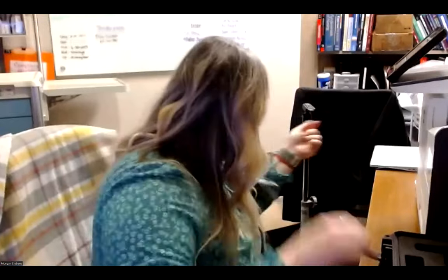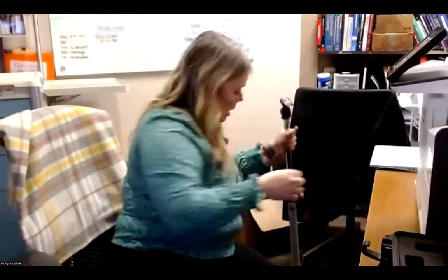As I'm showing you the bottom of this, it comes with a stand. Here's what your stand looks like. One of the things I found with this stand is there's a little bit of a trick to it. There's a button here. I'm gonna turn it sideways. There's a little button right here that you push. It doesn't take a whole lot. I actually had the colposcope in this and I bumped it and it slid right out. So you have to be really careful.